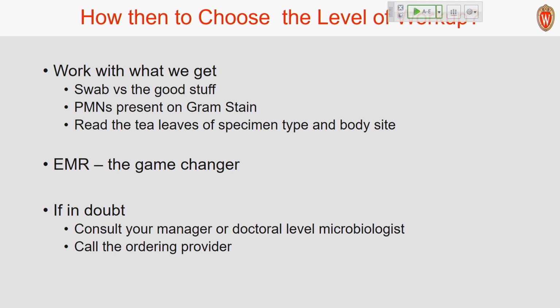And then certainly, for the more upper level people in the audience, encourage your techs to actually consult. Like I said, we go out in the morning and then we go out in the afternoon and say, hey, what's going on? Our techs will give us this information, and if they weren't able to find it out or they're too busy, we just walk over and pull up that EMR. Many of our techs are also comfortable with calling the ordering doc. Hey, doc, got this here, what do you think? What would you like worked up?